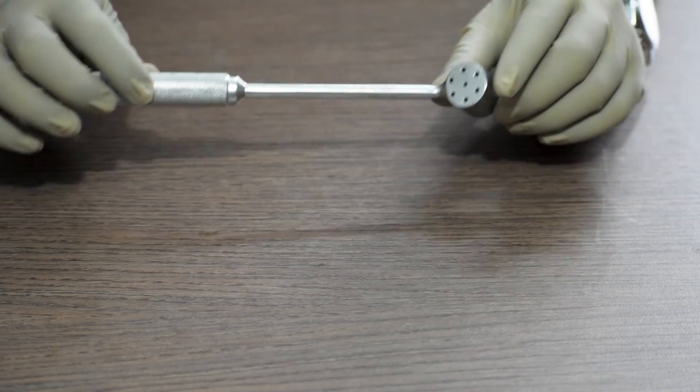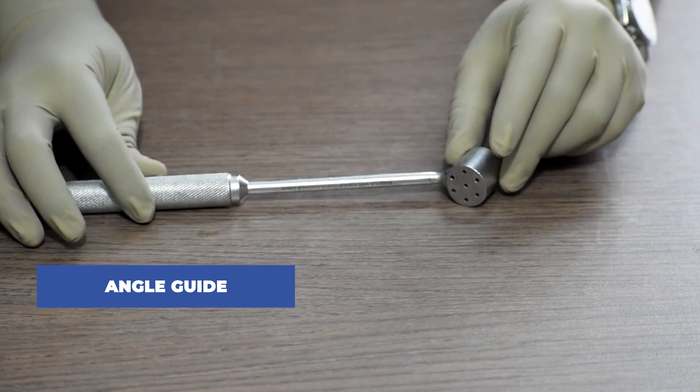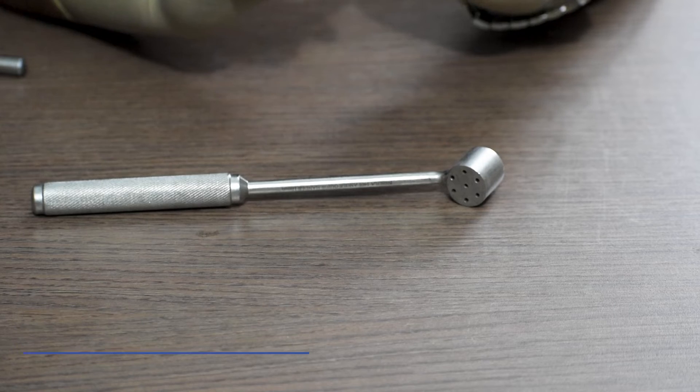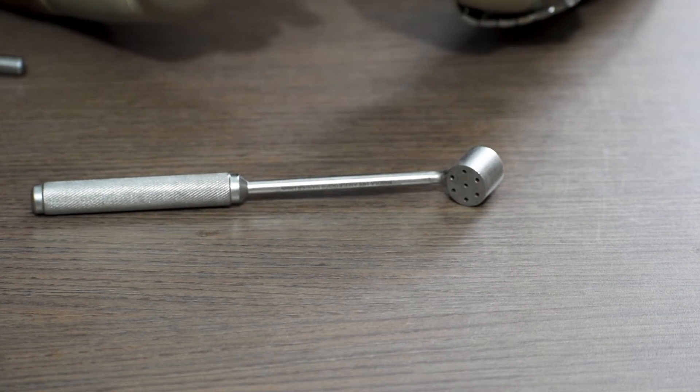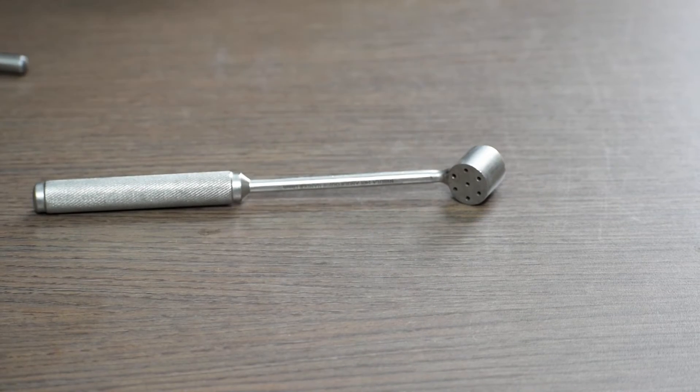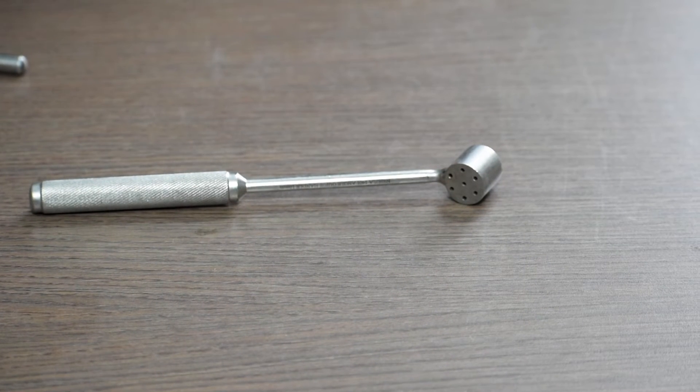Now, let us understand the use of this angle guide. This is only used when we require to fix this cannulated cancellous screw, 6.5mm, in the hip region or the neck femur.